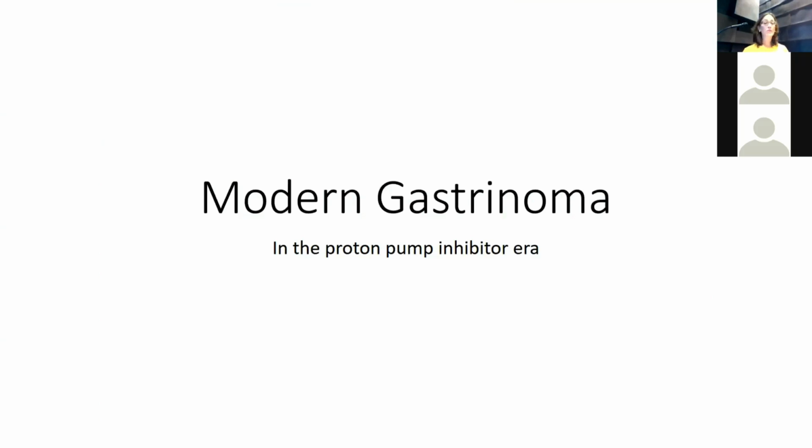So here's what a modern gastrinoma looks like. And you really have to have your little antennas up. I was lucky enough that I did on this case, but gosh, I could have missed it. I was crowing when I didn't, which probably means I screwed something up the next day.